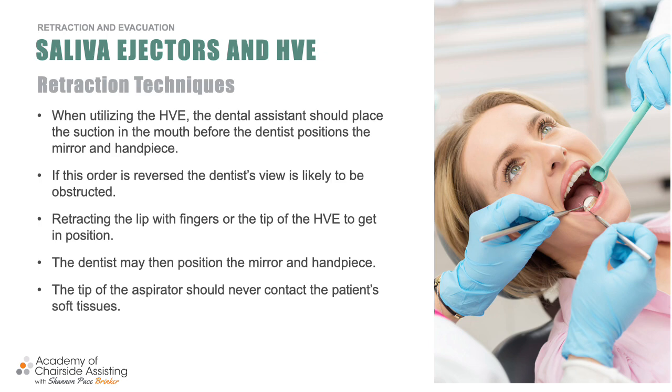But listen, let's be honest here. As a new assistant, I can't tell you how many times I've sucked up a patient's tongue or cheek. And even right now, if a patient is one of those that has that tongue that is like a wild animal, it's going to happen. And I'd be lying to you if I told you in my time I have never sucked up a cotton roll, because listen, I have. So it happens. And again, you're going to find your way. But one of the things I want to help you with today is giving you some ideas of some really good HVE retraction devices to utilize so this doesn't happen to you and makes your life just a little bit easier. But before we do that, let's talk about the grasp of utilizing the HVE.